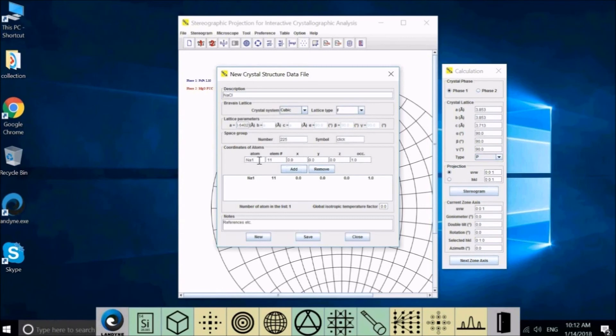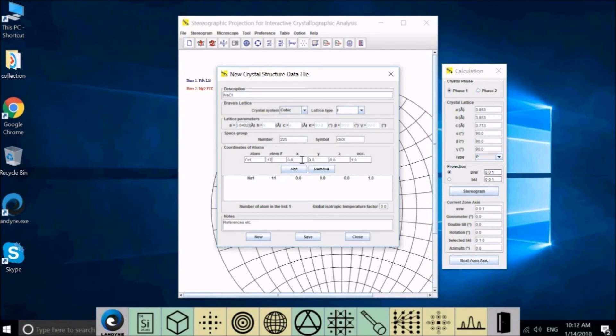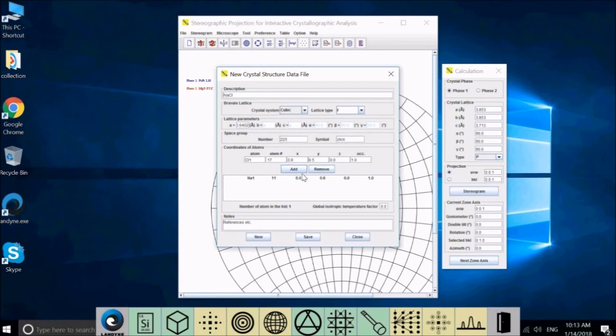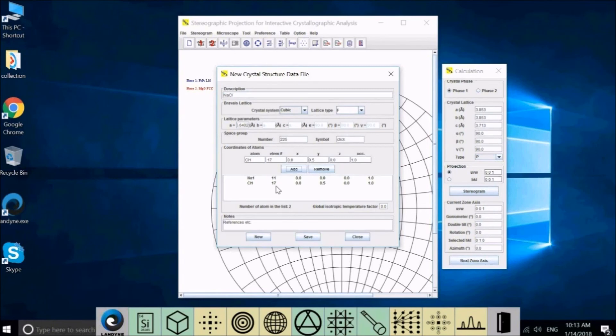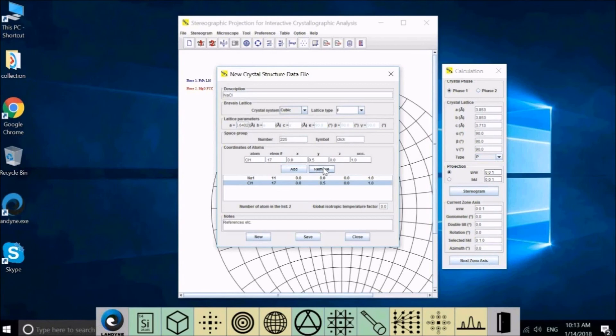Second atom is Cl1. Atom number is 17. So you see here are two atoms in the list. If you type something wrong or you want to modify any of the input, you can select the atom and remove. The number will come to here. If you want to change something, you can change it here and add again.